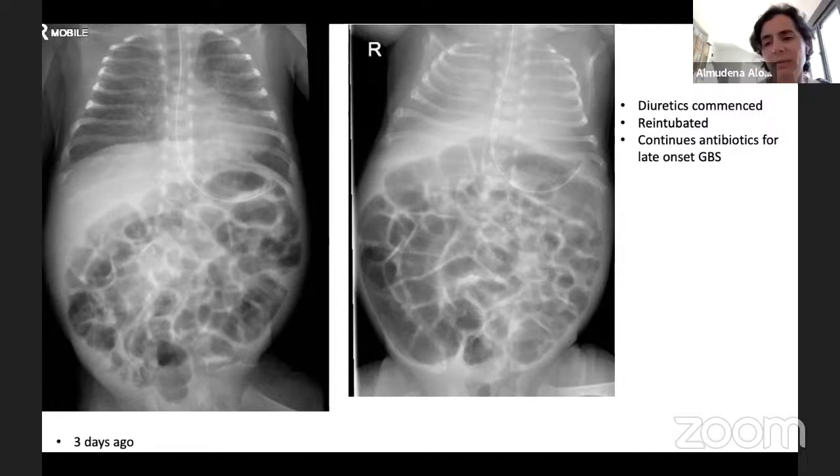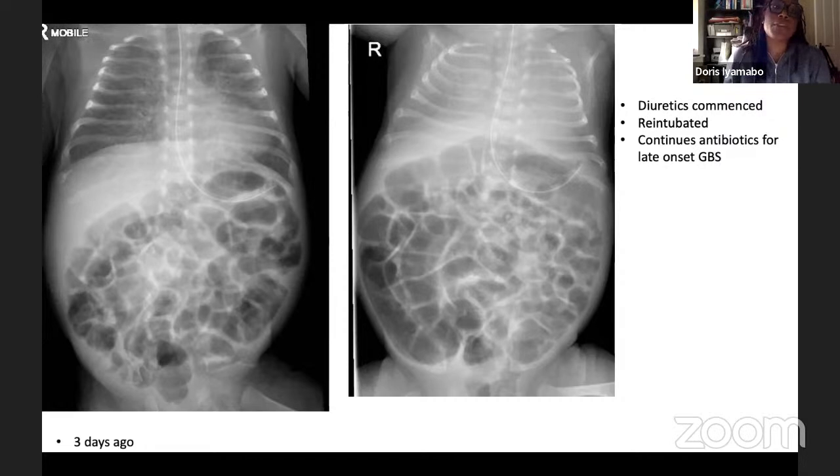So yeah, thank you. It could have been an acute RDS secondary to the sepsis also, but you wouldn't see the lung so homogeneous. You would see some areas with consolidation, small ones, bigger ones, other areas better aerated, like meconium aspiration syndrome, the images that you would see. But when you see such homogeneous lung all whiteout, that probably is an evolving BPD. Maybe you should also rule out pulmonary hypertension, if the baby has many fluctuations in oxygenation. Yeah. Okay. The oxygen requirements were close to 70 to 80% at the time of this x-ray. Okay, definitely needs recruitment. Yep. Intubated.